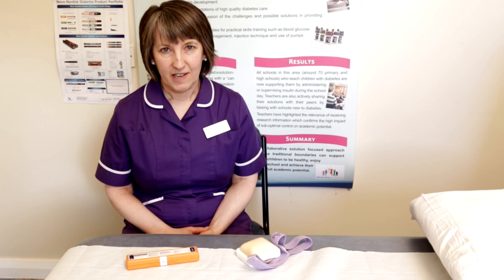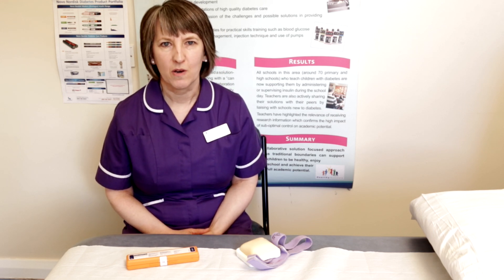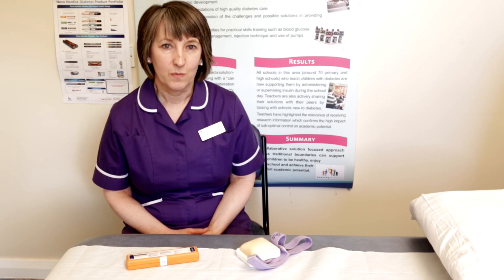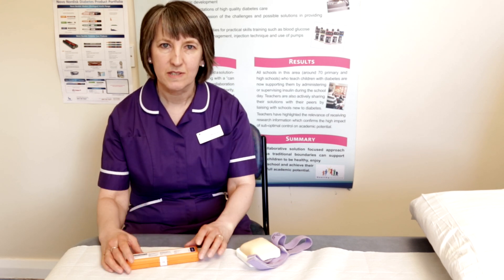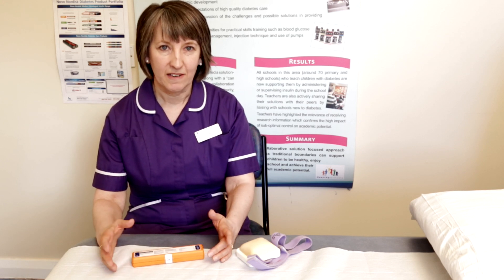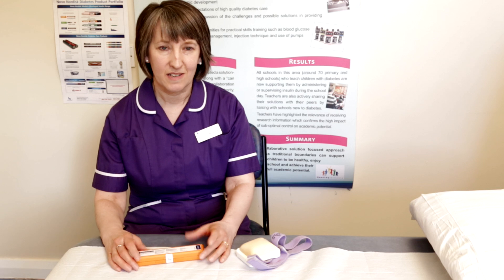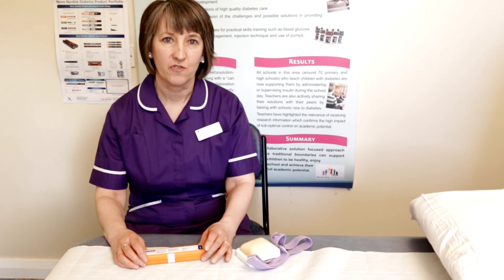You may need to give an injection of glucagon if your child or young person has a severe hypo and they will be unable to eat or drink anything, or they may even be unconscious. At this time, because it's an emergency, you may be a little bit scared and anxious, so I would advise you to call for an ambulance or get someone else to go and get help for you.